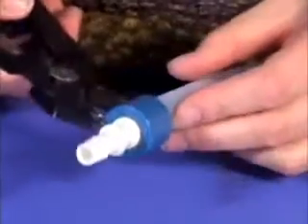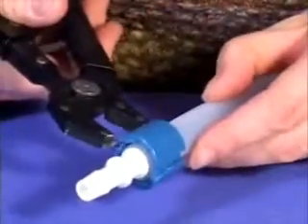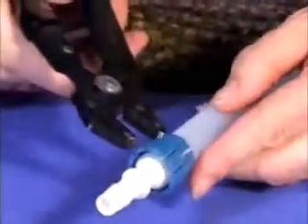Continue closing the pliers with a ratcheting motion until the pliers are closed. Make a second cut on the opposite side of the assembly. Carefully peel the sleeve from the assembly and remove the collet. The collet can also be slit with the URT if necessary.